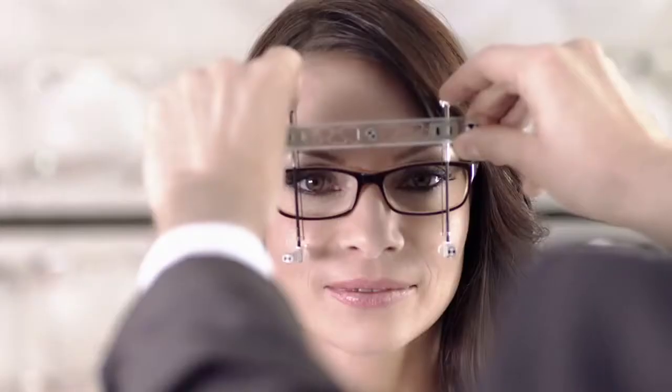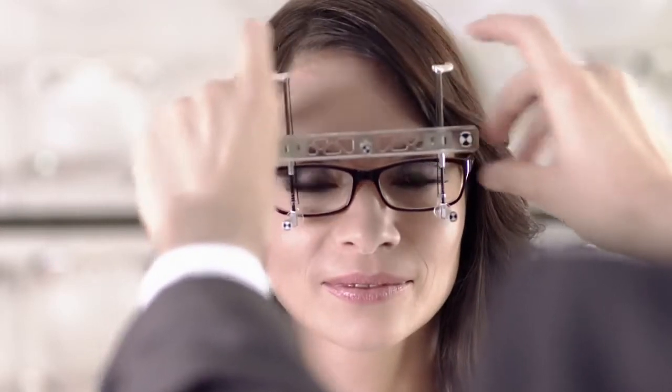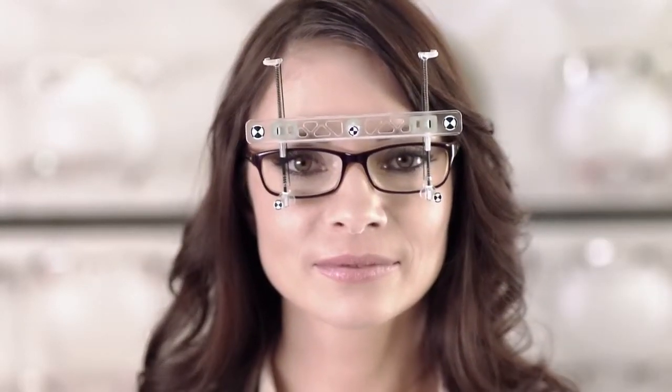Place the measurement tool with both hands on the frame. Press the spring struts down and apply the four hooks around the frame edge.